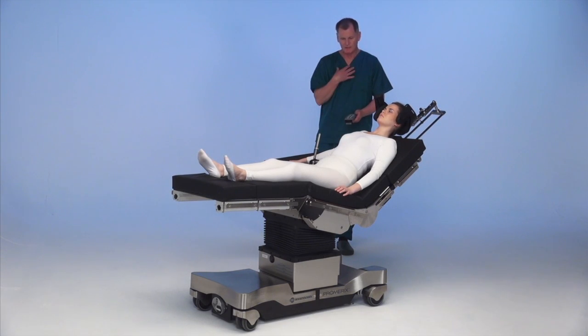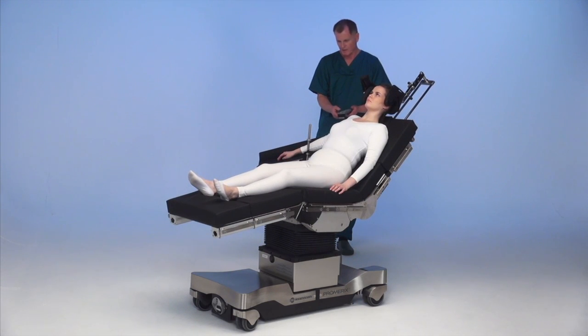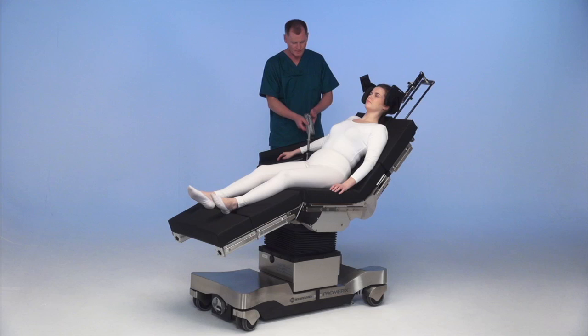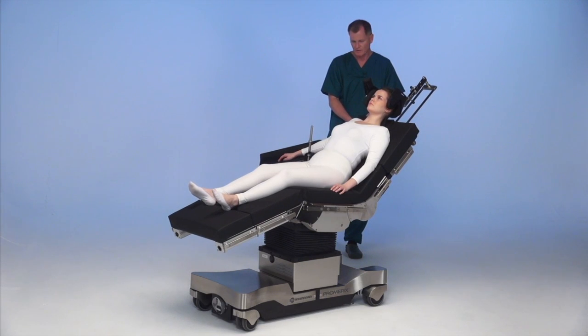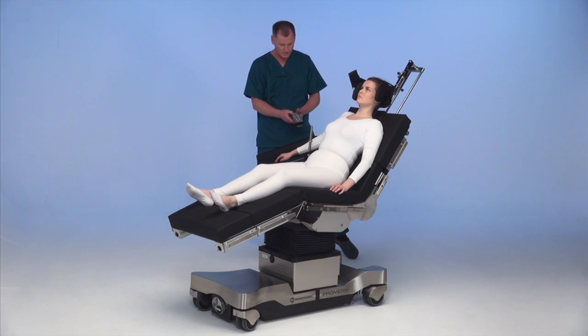For me personally, it's a little too much on the Trendelenburg. I'm going to reverse the Trendelenburg a little bit to get her shoulder up into a better position, then lower the leg plate down. I'm going to Trendelenburg her back a little more, then back up again. All right, so far so good — I like what I see.